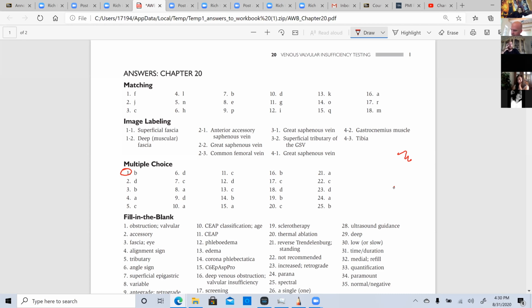I have to think about that, though. Let's see. A patient presents to the vascular laboratory for evaluation of valvular incompetence. Venous PPG examination performed. The results demonstrated a venous refill time of 10.5 seconds without the use of a tourniquet and 22 seconds with the use of a tourniquet. Okay. Think about that for a second. Deep venous reflux, right? Number 22. Presence of superficial.